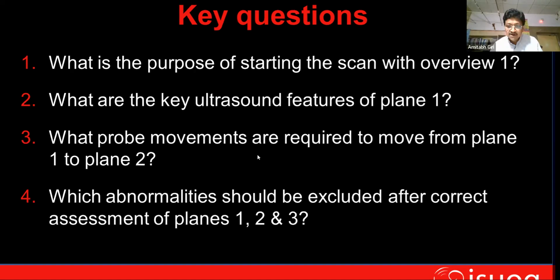Required to move from plane 1 to plane 2, and which abnormalities should be excluded after correct assessment of plane 1, 2, and 3.